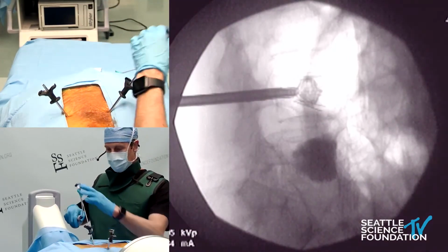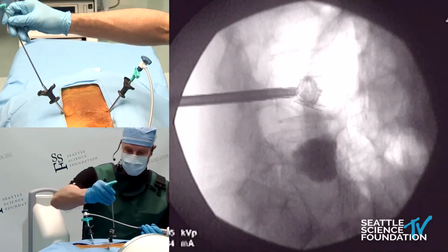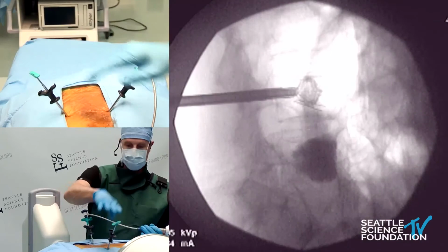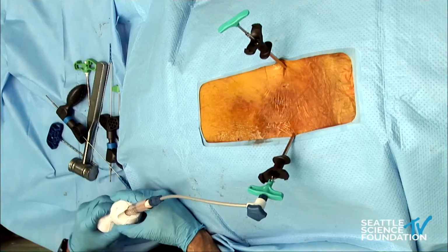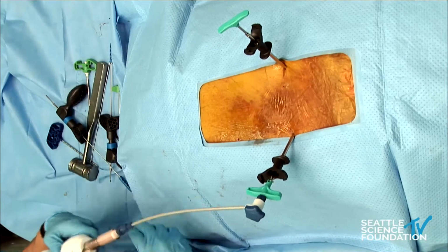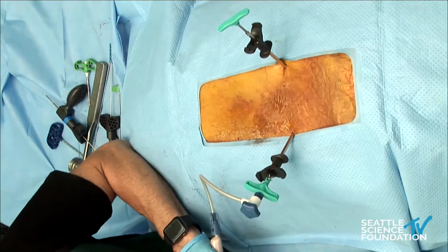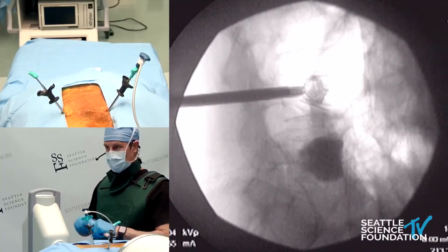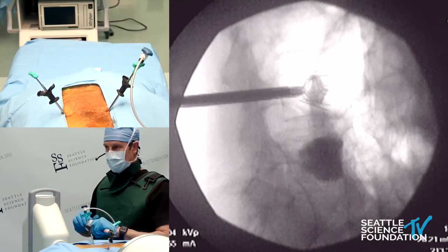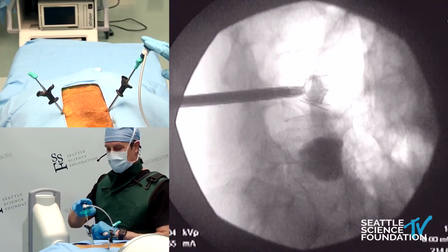So we'll inject on one side. I'm actually going to use the internal pusher on the other side so we don't get cement coming in one side and back up the other. So as the cement comes out in the anterior portion, we'll go up and down the jack. You can see the cement moving that way, up and down the jack.